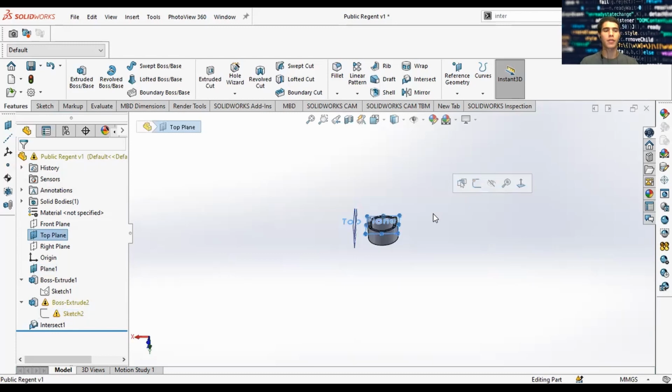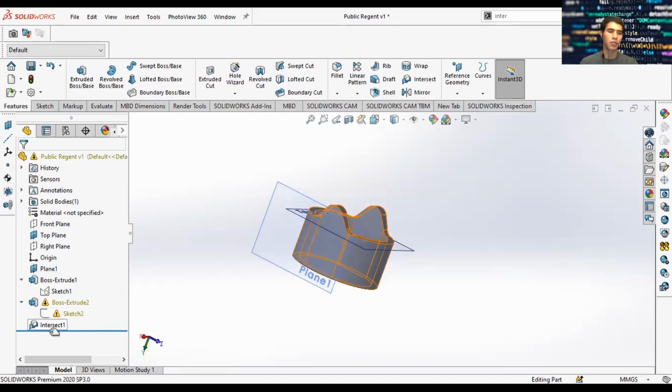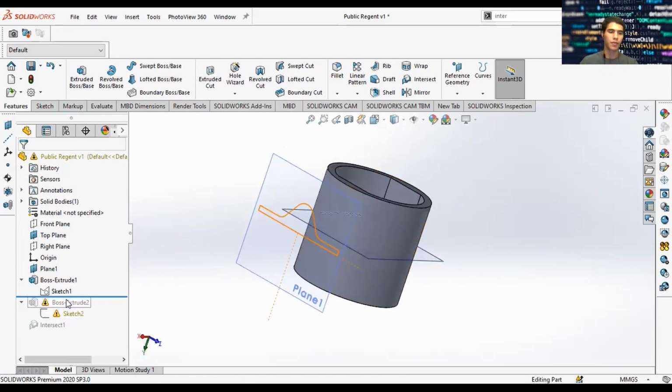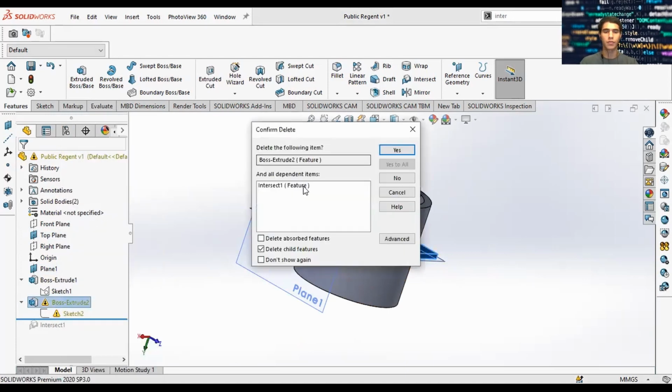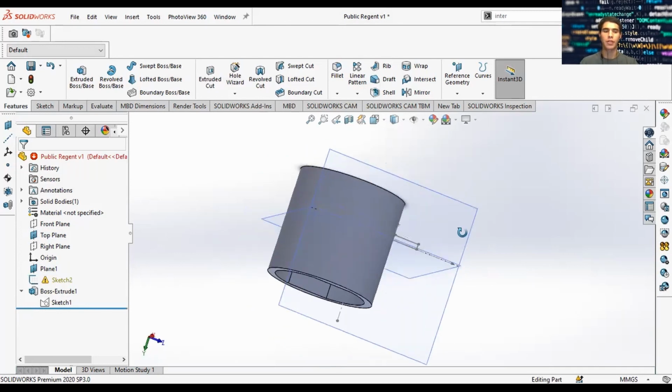So there's just a warning and an error. You can live with a warning. The way you would fix this is you just go back and you would redo that feature. So let's go ahead and do that. So here we are back to our feature, and we bring back the rollback feature. We delete the extrude, but we don't want to delete the intersect. And now we can go back and edit our sketch.